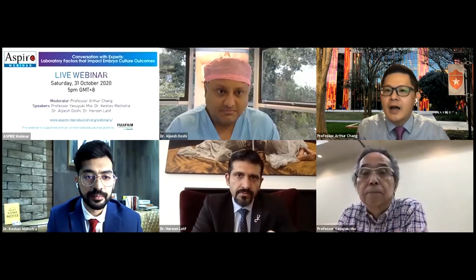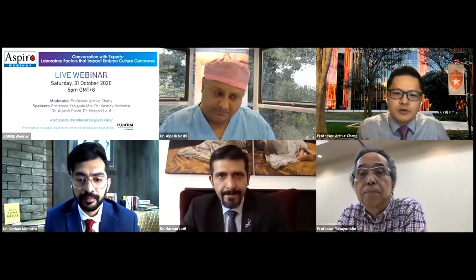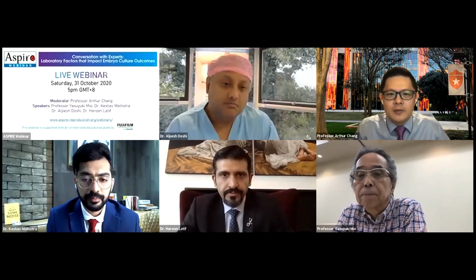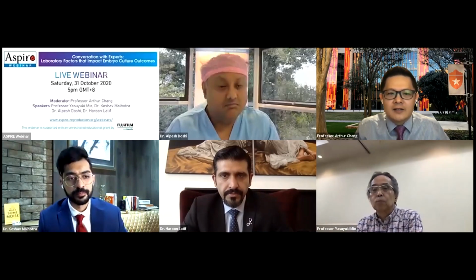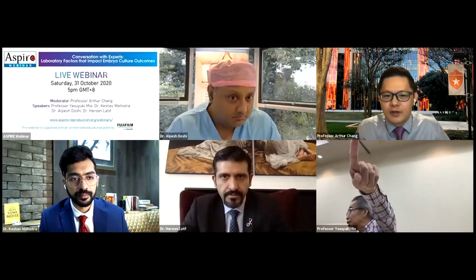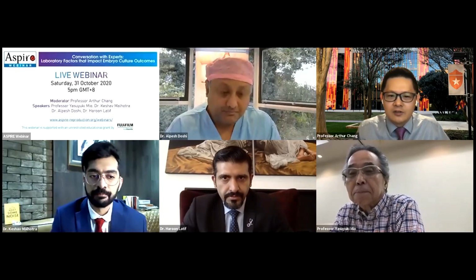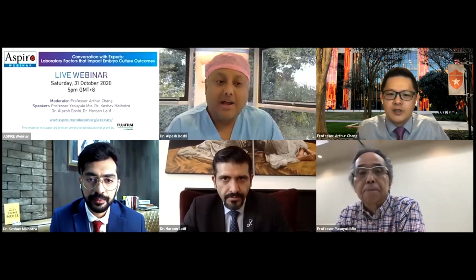Great. And actually, I have a follow-up question regarding the laser. So oftentimes we have to do a day 5, even though, for example, I do day 3 laser drilling also, the zona drilling as well. But oftentimes we see some embryos grow out on day 5, and maybe the hole we drilled on day 3 is on the ICM, so I have to drill from the other side. And oftentimes some labs will do day 5 exclusively. So is there any suggestion on how to do that? Because the zona is thinner, then you have those mural trophectoderm cells attached. What's your advice on drilling on day 5?